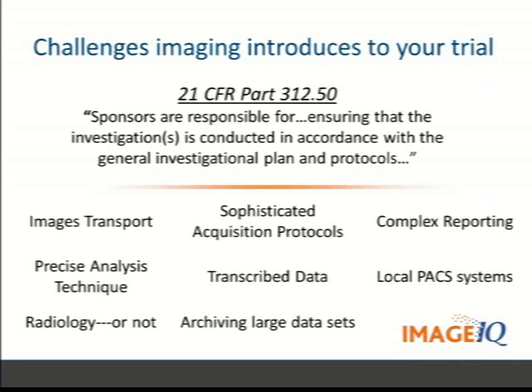Right. This concept of local PACS systems, where radiology especially is being pulled into local PACS systems, and you've got to deal with issues about blinding and making sure that overreads are done correctly and patient, subject identification is handled correctly. There's all sorts of stuff.